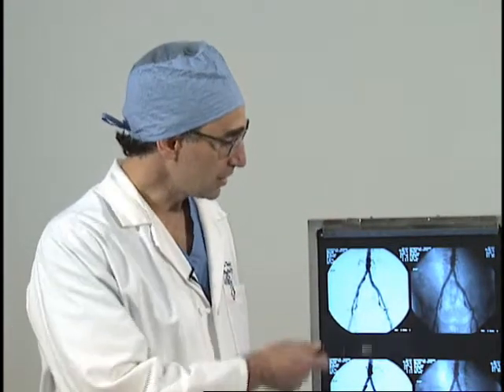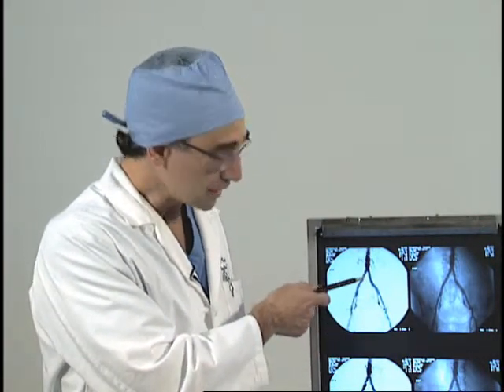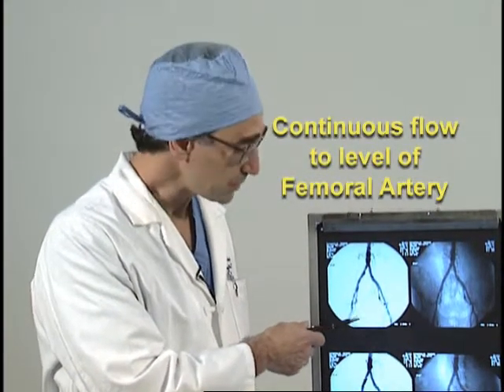this treatment protocol. As a prerequisite for enrollment, a patient must have adequate inflow into the leg. This angiogram demonstrates an essentially normal aorta and iliac arteries. It's mandatory that there be continuous flow to the level of the femoral artery for enrollment in this trial.